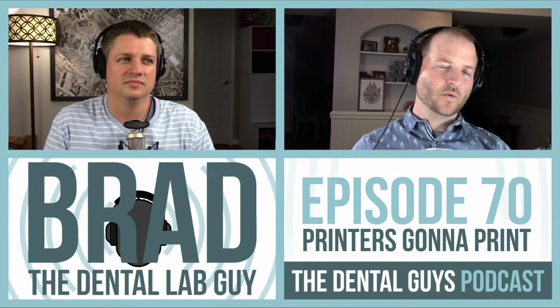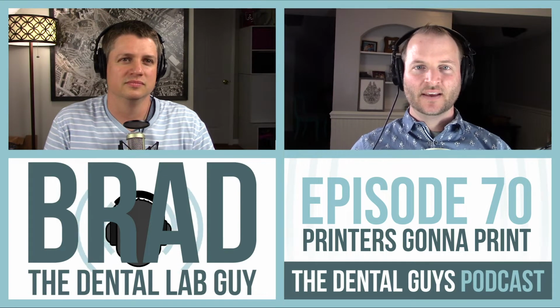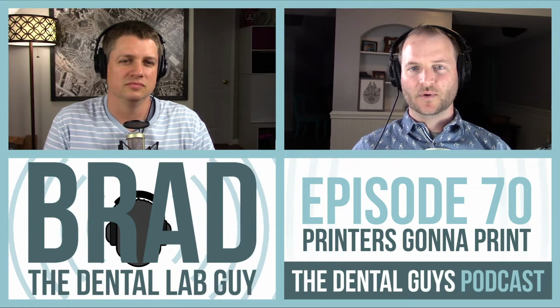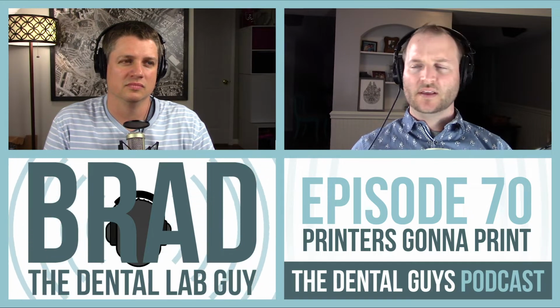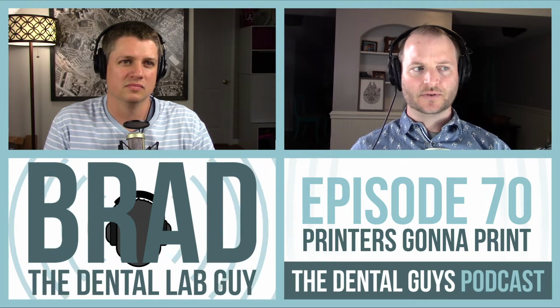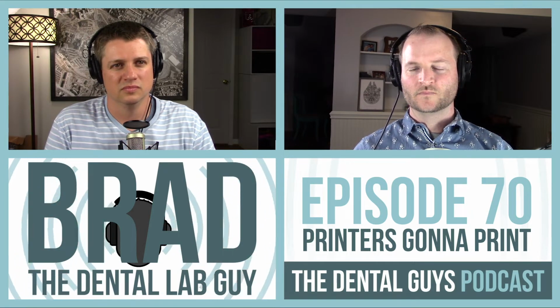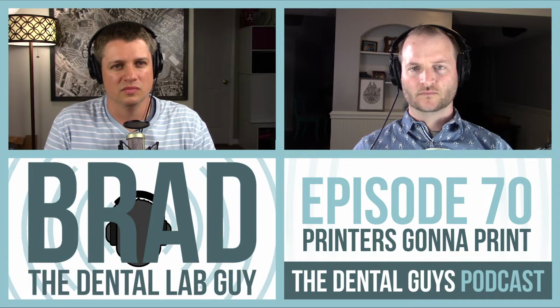I really think that the question people most commonly ask, the thing that gets debated a lot, is accuracy and precision. So, Brad, I want you to speak to this, because you've come a long way in this technology, with the technology changes that you've seen. What do you think the accuracy and precision at this point of 3D printed models is compared to stone? We scan in, and we've done some studies on this. We're about 98% accurate with our 3D printer compared to stone.